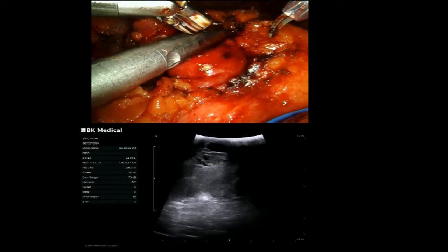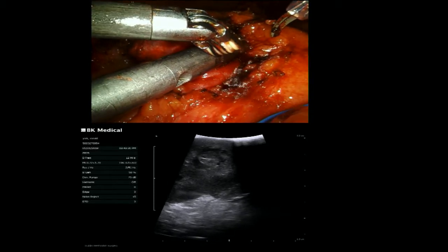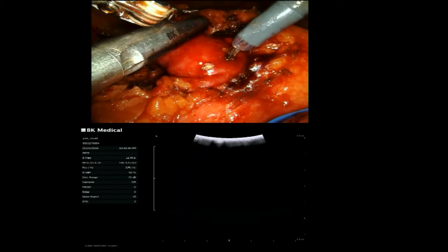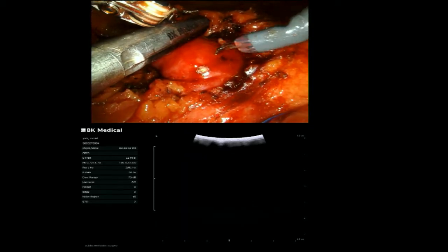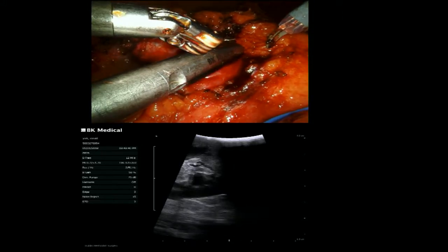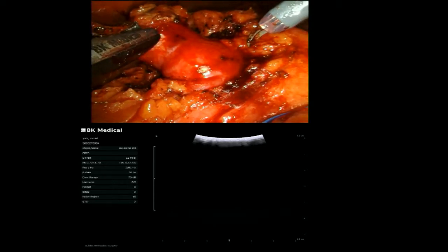So here we'll find where we're going to cut. We're going to cut here, and then I'll rotate the head. There's tumor there, and then I go away, boom. So I got to cut straight down here. I got to cut right down in this direction. I can't cut this way. If I cut this way, I'll get into the tumor. So here, based on this rotation, that's tumor, that's not tumor. So I got to cut a little bit down in this way. Does that make sense? Mm-hmm.